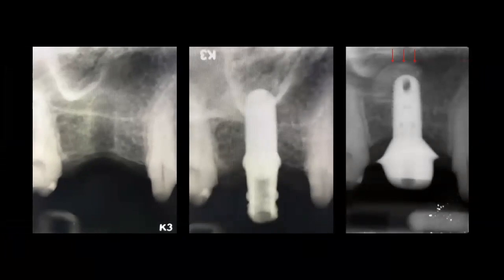Now, do I use any type of allograft material for this? And the answer to that question is yes. Before I place my implant, I'm going to add a little bit of 70-30, a mixture of 70-30 mineralized and demineralized bone within the socket. And then while I'm placing the implant, and this is a 5.0 Zimmer implant, while I'm placing that implant, I'm going to push that bone into the sinus.